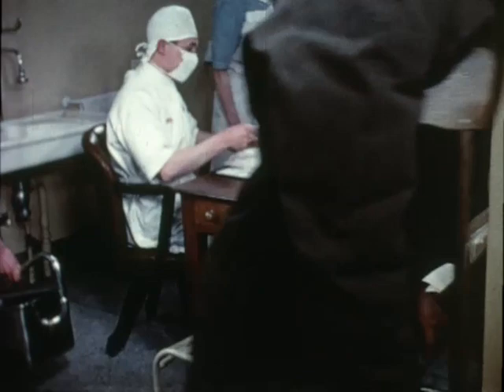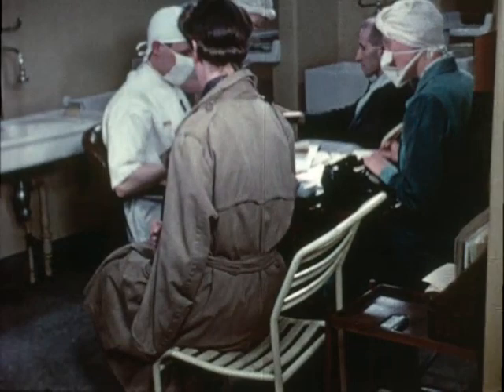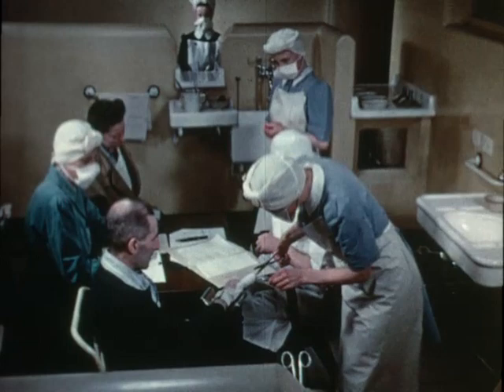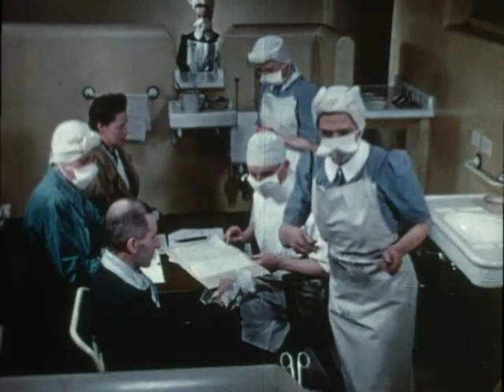As soon as the patient goes out the nurse takes the limb rest away to be sterilised. Meanwhile on the other side of the table the nurse has already started to remove the dressings from the next patient. Notice in the background the two openings between the dressing nurse and the server. Against the side wall is a slab on which the clean material is stored. Below it is the discard bin, and in the centre is the hatch where dirty instruments are passed out to the server.